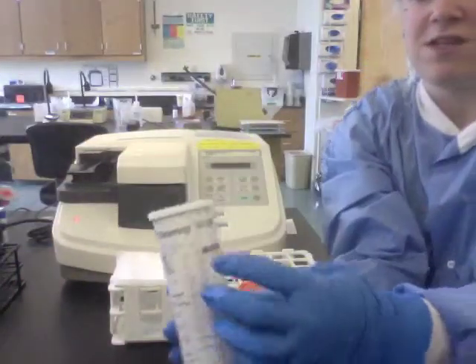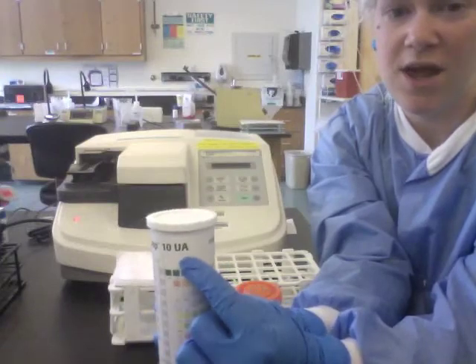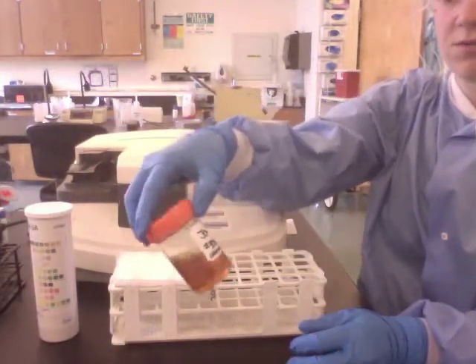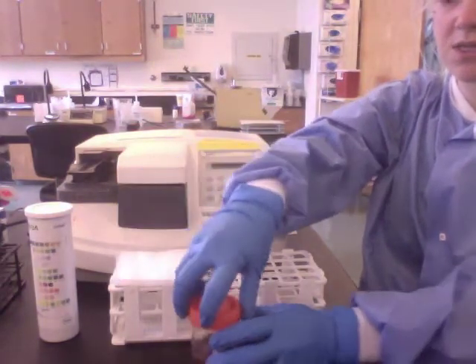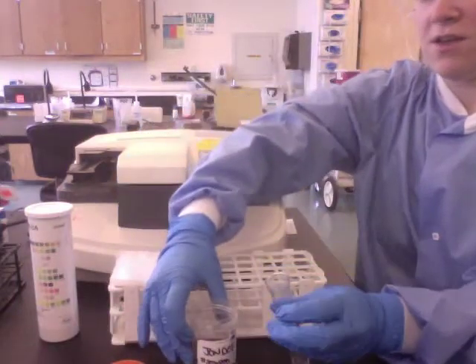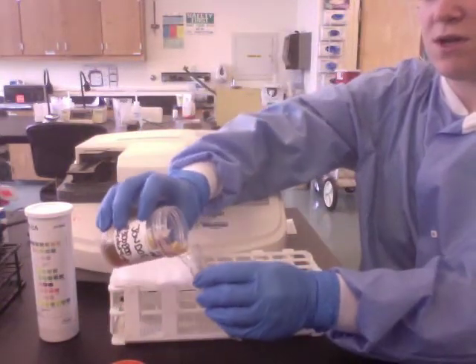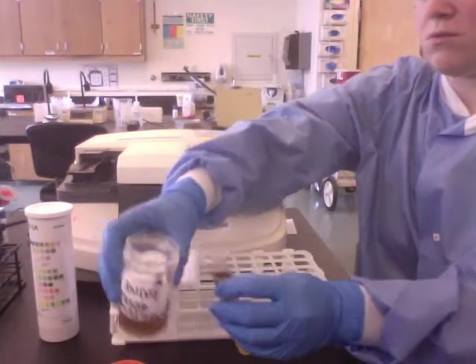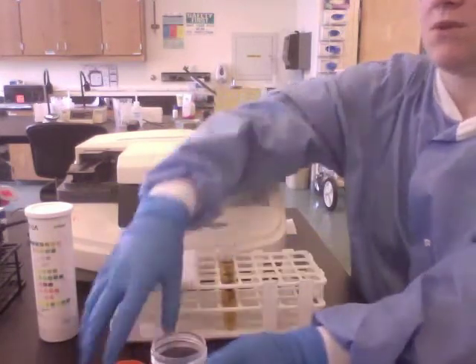We have to use the ChemStrip 10 UA without SG. First, we want to be sure our urine specimen is well mixed, then decant that urine specimen into a conical tube. Promptly recap your specimen.